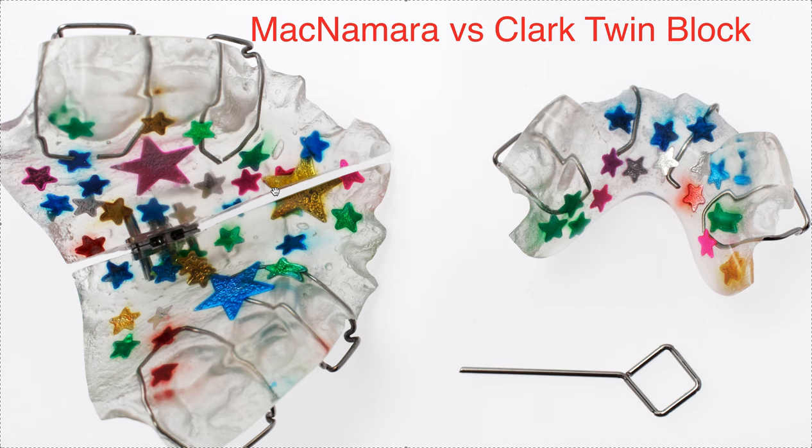My suggestion now: if you're going to order a twin block and you're looking to develop the arches and have either a sagittal or a transverse screw, then if you want extra retention with a labial bow, say McNamara twin block with a labial bow with a transverse screw. However, I find having labial bows and a transverse screw is often contraindicated, because it's like you're trying to expand but yet you have a bow that's going to prevent expansion. So I don't recommend doing both together.